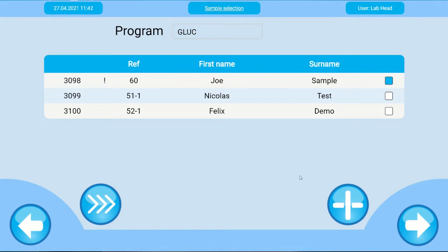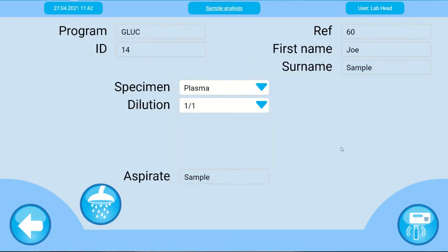In the event new patient samples are received that also require the glucose test, you can still include them by pressing the add button. Continue to perform the glucose test. On the following screen you will see the patient details.